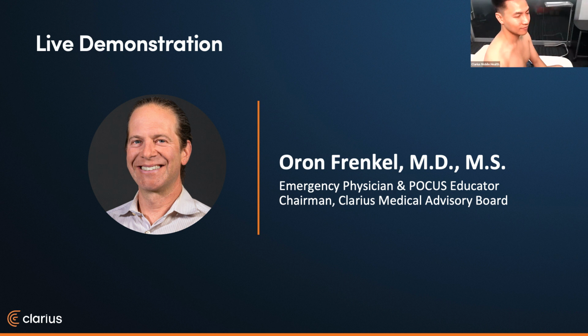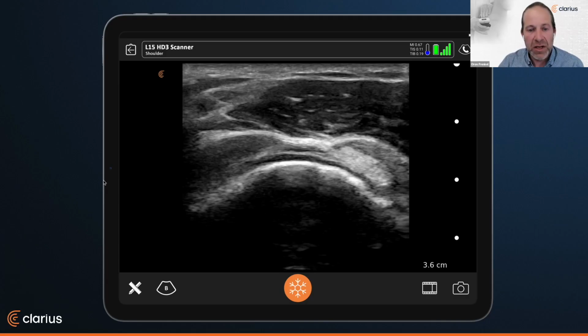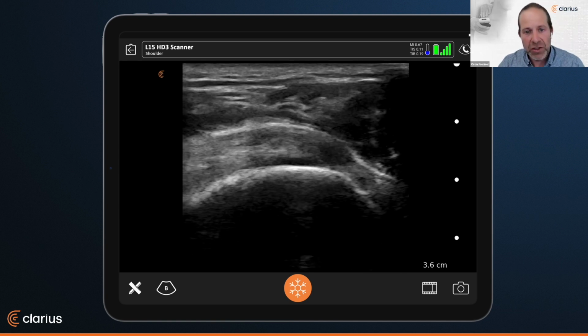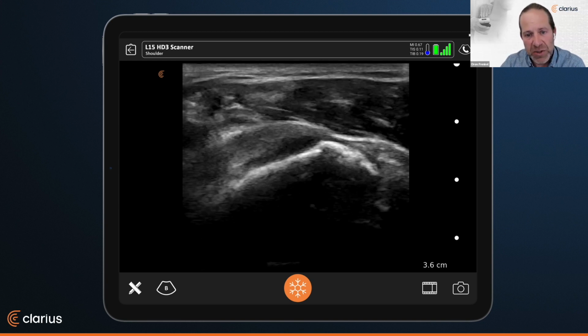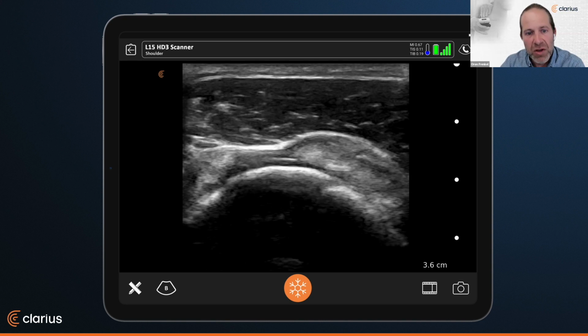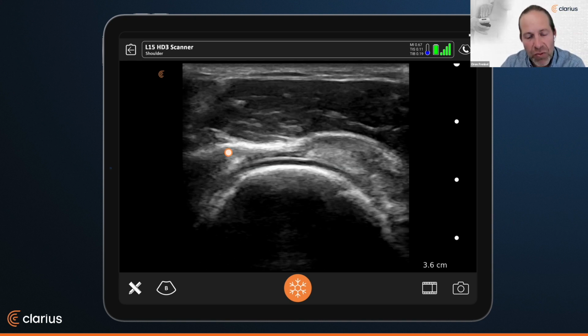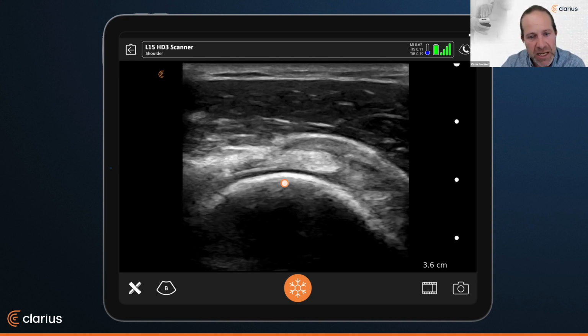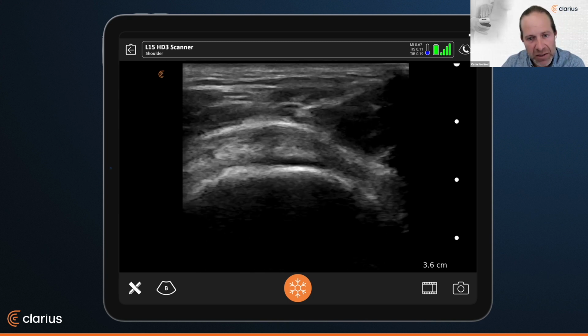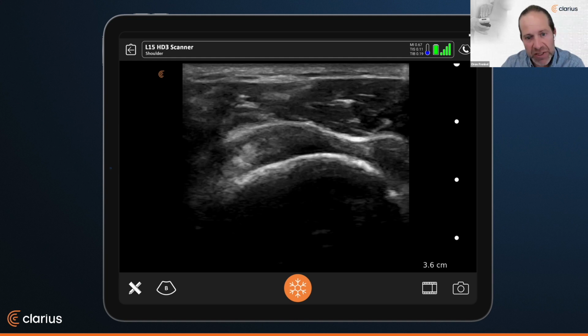A little bit of bursal effusion, but nothing to worry about. Right. This is not in a dynamic state, but here we're rotating the humeral head, and this is the supraspinatus, and we see this discontinuity in the rotator cuff. Would you say that's a nice example? Right next to the interval, it looks like, with loss of that continuous tendon, suggestive of a tear. We need to know a little bit more about the patient and how they're presenting to really identify.